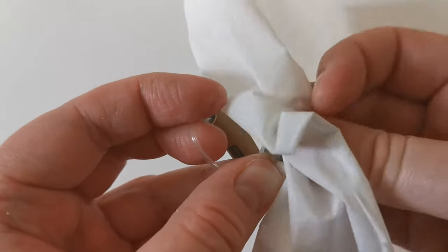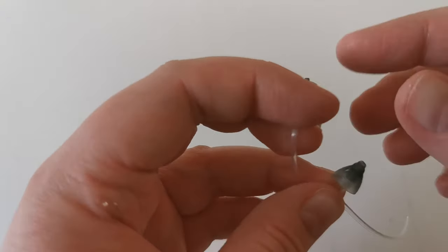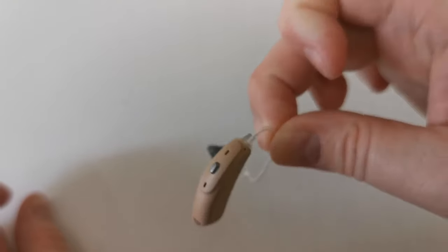It's best to clean one hearing aid at a time so that the wires don't get mixed up. And that's how you clean a hearing aid.